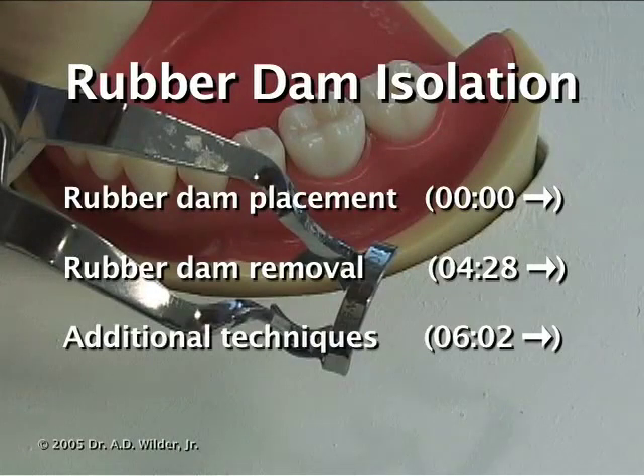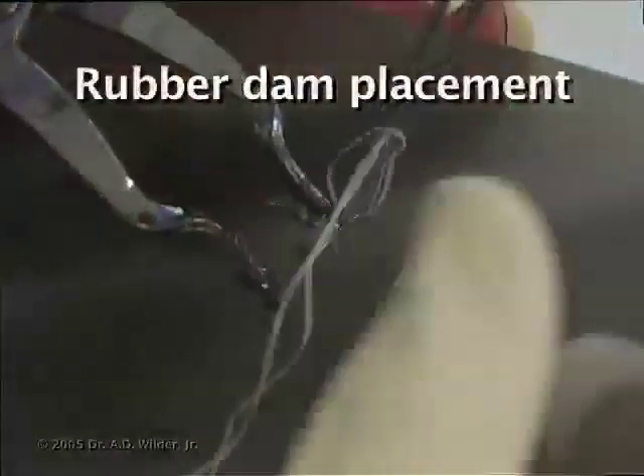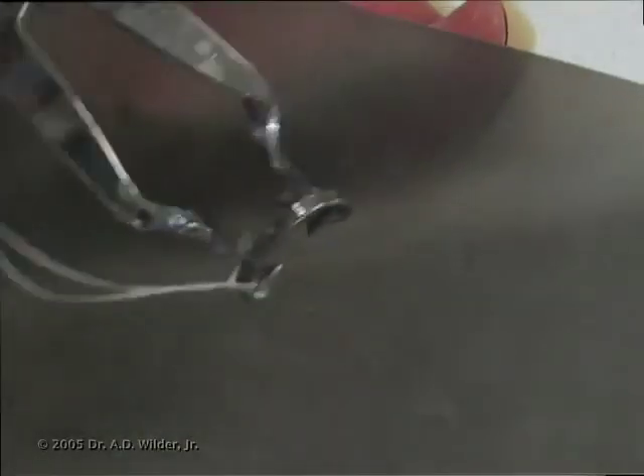Thank you to Dr. Wilder for preparing this video. First, tie floss around the bow of the rubber dam retainer, also called a rubber dam clamp, using a pair of cotton pliers.